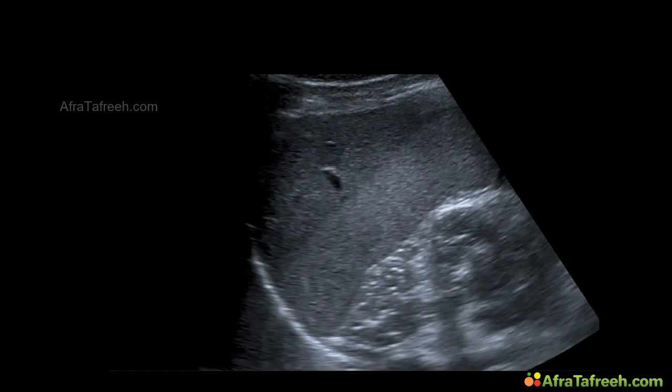When we scan the left upper quadrant, we find this hyperechoic tissue over here, and in the very uppermost edge of the left upper quadrant, the slightly hypoechoic parenchyma over here. In this particular case, we find an enlarged liver that gets in touch with the spleen in the left upper quadrant. So a kissing of the liver with the spleen. We should not mix it up with a hematoma.